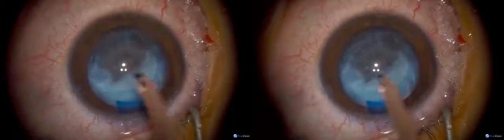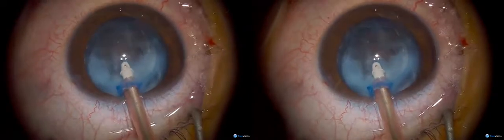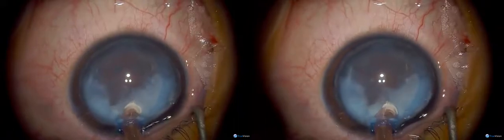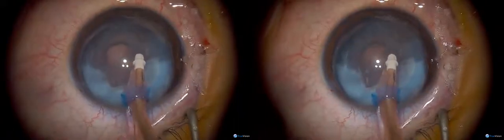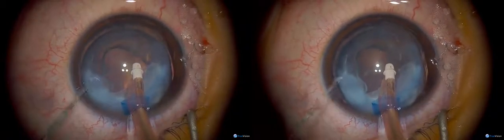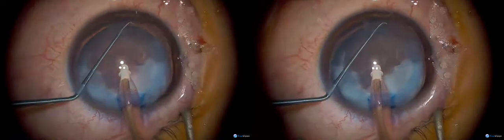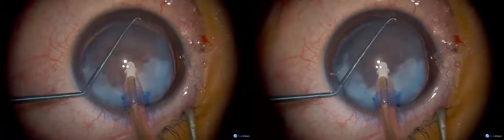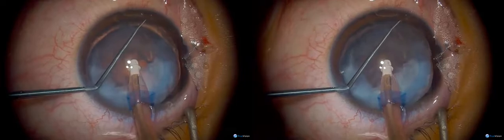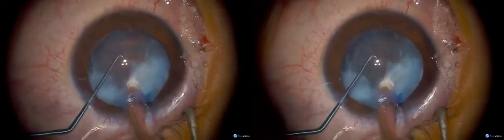Okay, so we'll just try the IA now please. Are we on IA? Cortex — that's great, thank you. You'll notice how the anterior chamber has deepened a lot when I put the infusion in, and that's due to reverse pupil block. I'm going to use what's called the Cioni manoeuvre, described by Bob Cioni, to lift the iris up, and that shallows the chamber again.